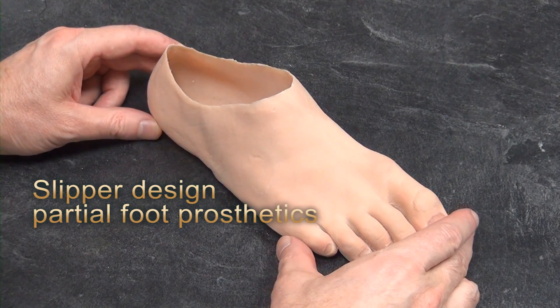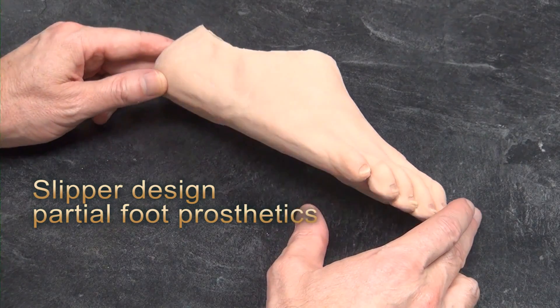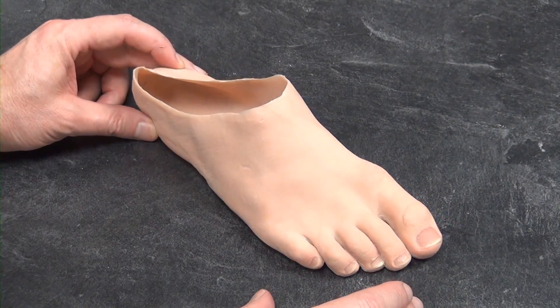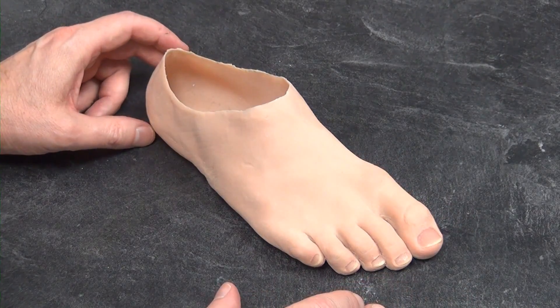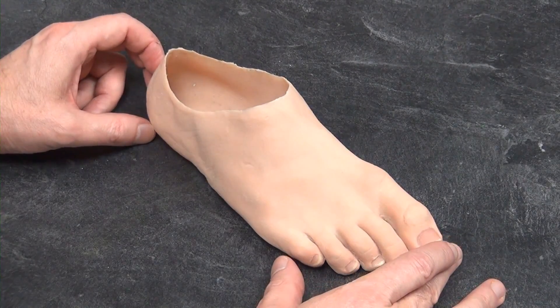Hello everyone, I'm David Van Ucker, MACPCCA — that's Master of Arts, Certified Prosthetist, and Certified Clinical Anaplastologist. I'm here today to talk to you a little bit about the partial foot prosthesis.